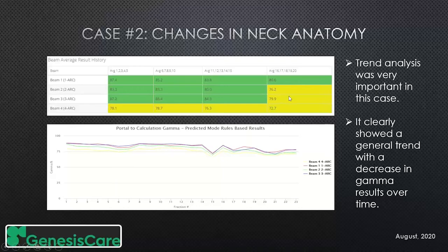So in my opinion, on this particular patient, this was enough information to prompt me to talk to our radiation oncologist and first see if he wanted gammas, and he did. He changed his prescription and requested gammas on the prescription. So now the reports would go into the patient's medical record.